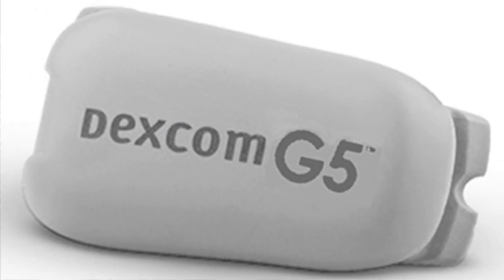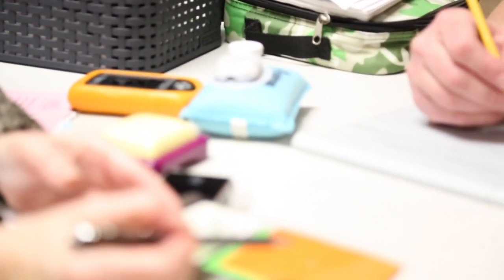So with the Dexcom, you would wear something like this. It has this clear thing, which is the sensor, and you insert a hair-like sensor. Truly, they said it was smaller than a hair. I would say it's about like a hair. It stays in your body like 7 days. It's FDA approved for 7 days. With your pump, traditional pump versus the Omnipod, this gets changed out every 3 days. There's reasons why it can't stay on for longer than that. Valid reasons.